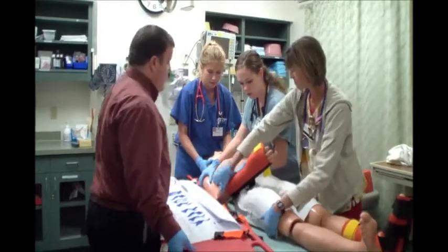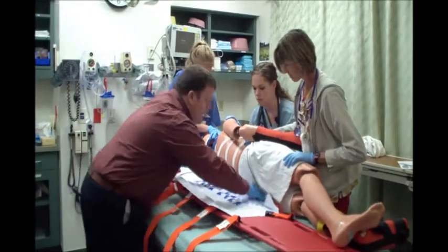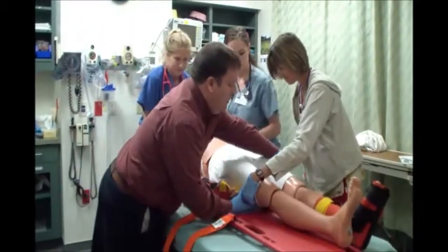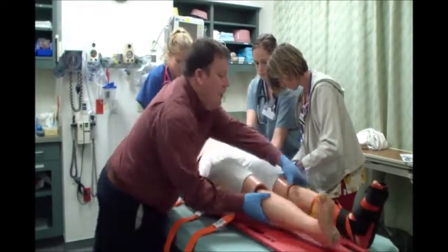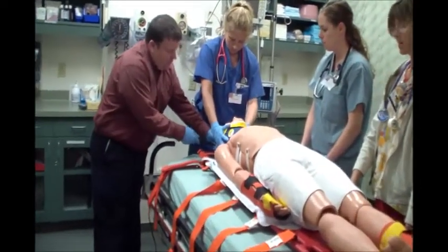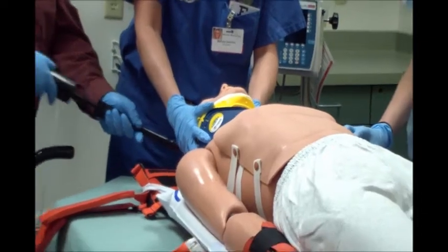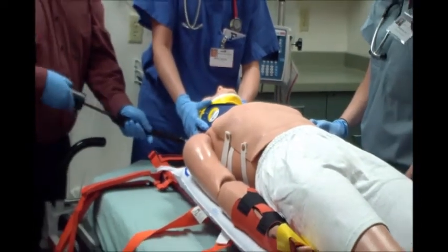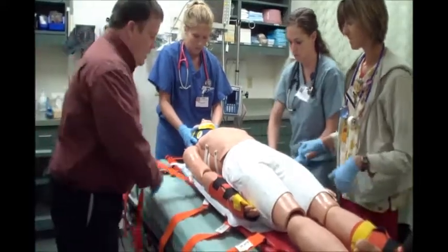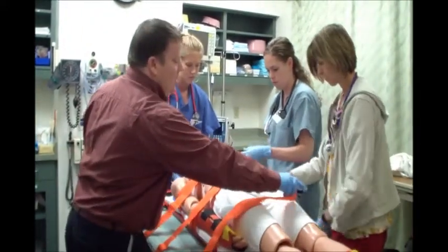Ready? Okay. All right. 1, 2, 3. Roll the patient up, inspect the back, look for any skin issues to begin with. Okay. 1, 2, 3. Inflate the raft. Again, just looking that the voids are filled and see the shoulders just start to raise just a little bit. The patient might also be able to let you know that it's more comfortable. Re-secure the straps. Document that padding was placed, the skin condition, and you're ready to go.